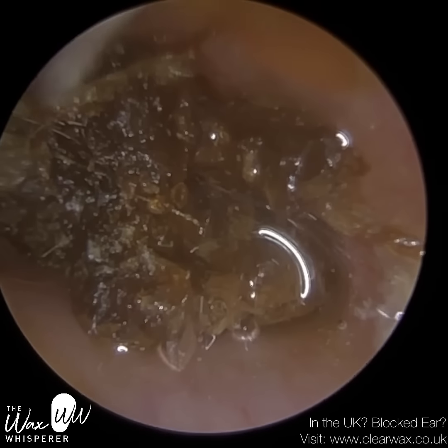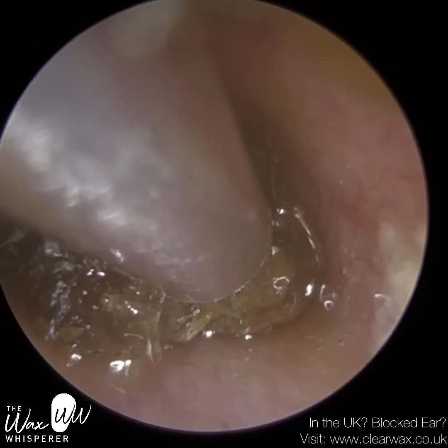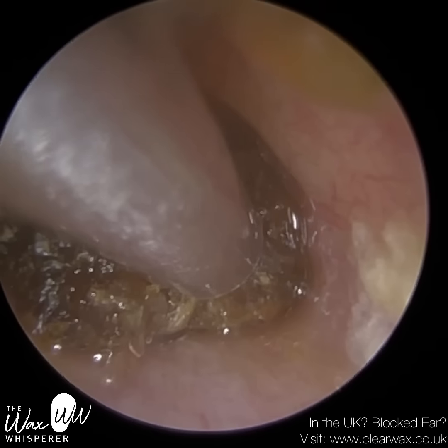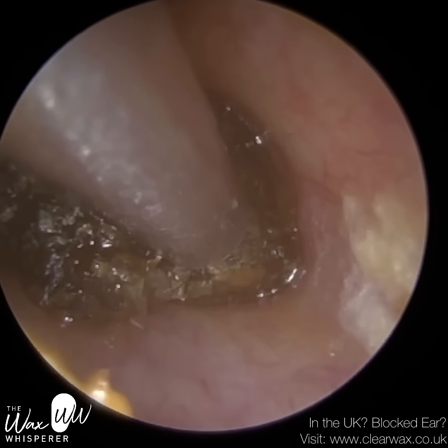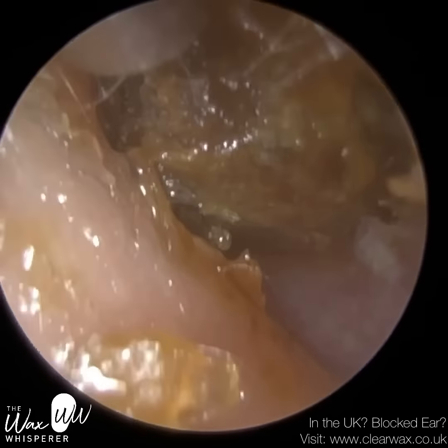I've put some more olive oil spray — not too much, just enough at the bottom. So I'm going to target this bottom section, get a suction grip, lift up and away, and just tease it off the eardrum. There we are.